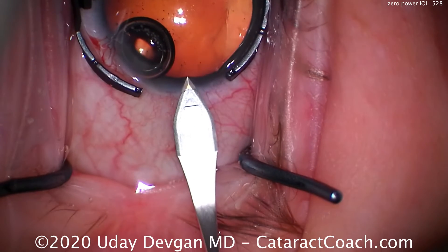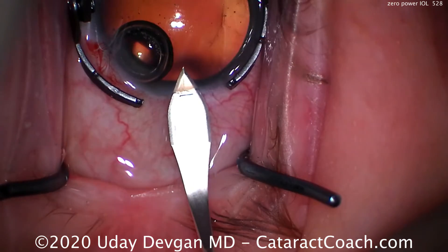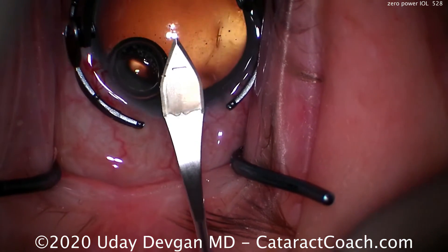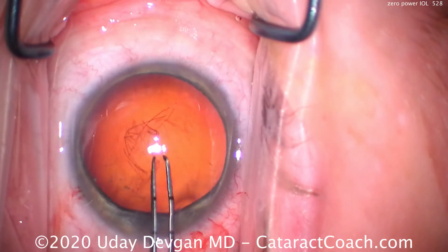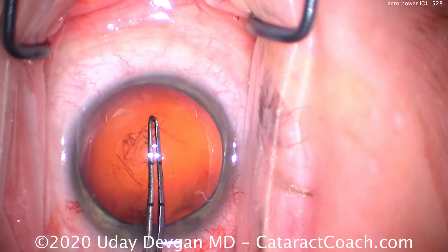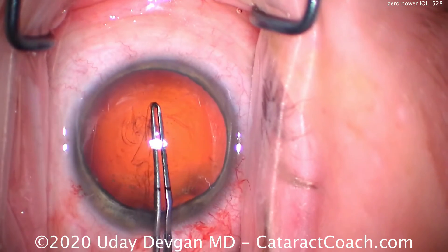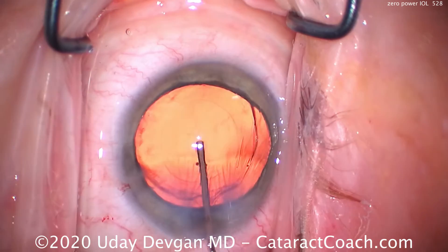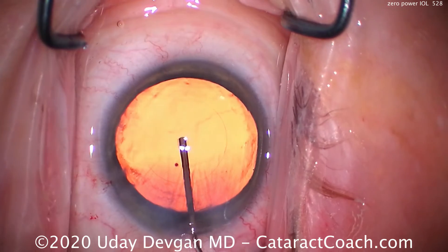The case is otherwise routine. We're going to make our incision here, and we're going to speed through the case quickly just to talk about the IOL. There's the incision. We achieve a very nice capsulorrhexis — important to measure it to make sure we have a good five-millimeter capsulorrhexis to overlap that optic, which is six millimeters. And then let's cut to the end of the case. Fill in the capsule bag with our cohesive viscoelastic. There's the capsulorrhexis — looks great.